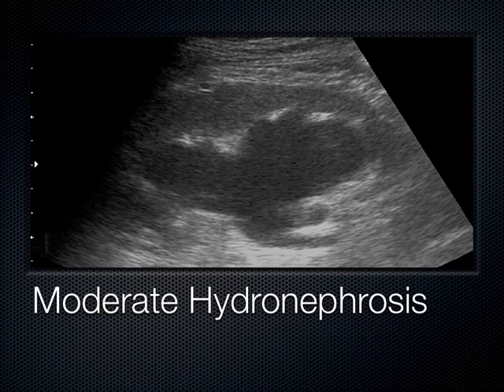This is what happens when we get a lot of hydronephrosis backing up in the kidney. Our cortex is starting to go away, and all those finger-like projections are now coalescing to one large hypo or anechoic area here seen in the pelvis of the kidney, and that's more like moderate hydronephrosis. When all those fingers kind of come together, we can still make out the cortex though. See out here, we can still see cortex. If all I saw was a big black center where the kidney should be, and there's no cortex left, it's very, very rare, but that would be severe hydronephrosis. The fact that I can still make out cortex to me tells me this is probably moderate.